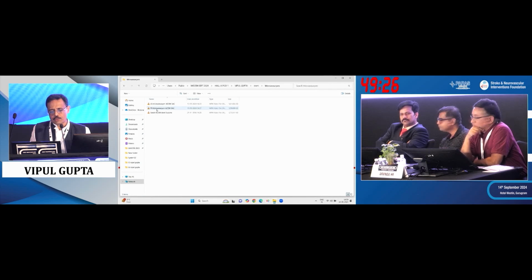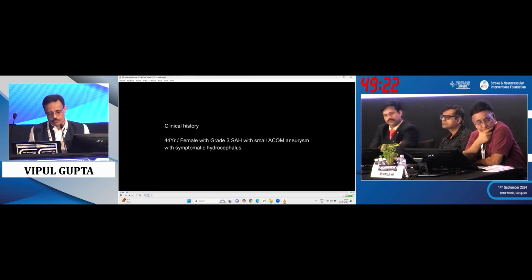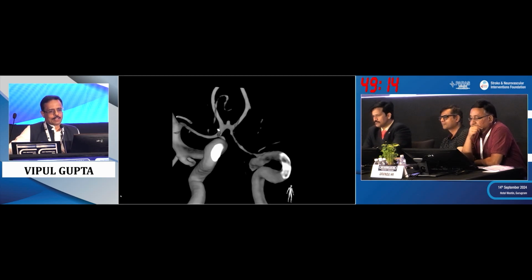Coming to another acute situation, let us come to this. This is a 44-year-old female with acute subarachnoid hemorrhage, and that's the aneurysm. What do you say? You remember you showed in SLICE and you placed a flow diverter from A1 to A2? You had an irregular ACOM aneurysm like this.